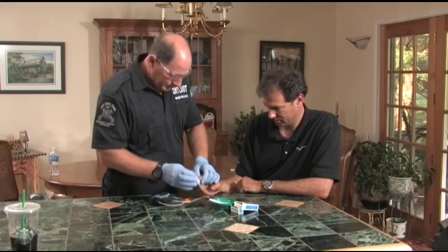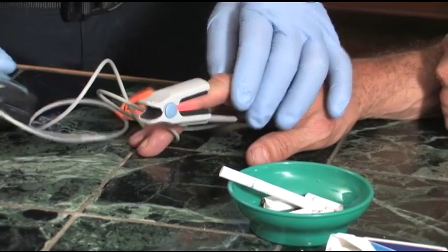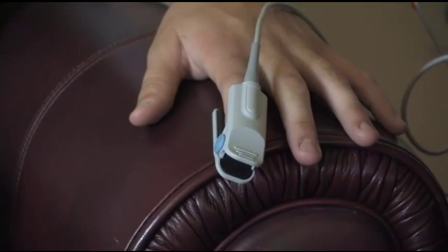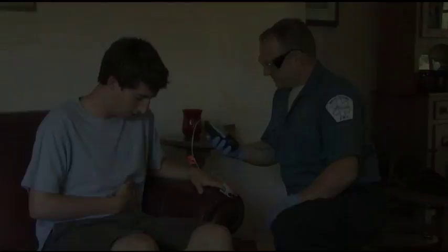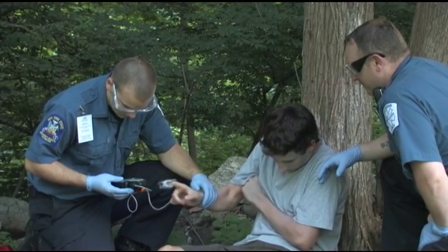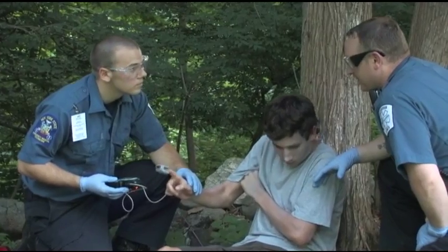When using a pulse oximeter, keep in mind that readings will not be accurate in all patients. For example, patients exposed to carbon monoxide, including chronic cigarette smokers, may have falsely high readings because carbon monoxide binds to hemoglobin. Anemic patients and patients who have ingested certain kinds of poisons may also have false SpO2 readings. Hypoperfused patients, including patients in shock or hypothermic patients, do not have enough blood flowing through their capillaries for accurate readings.